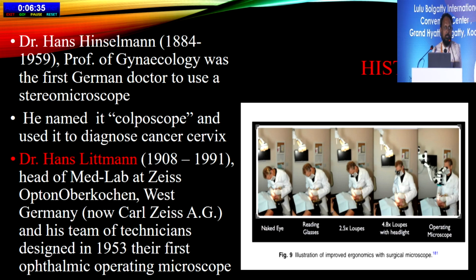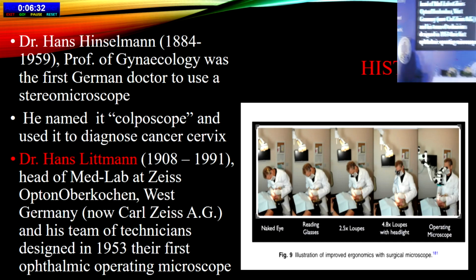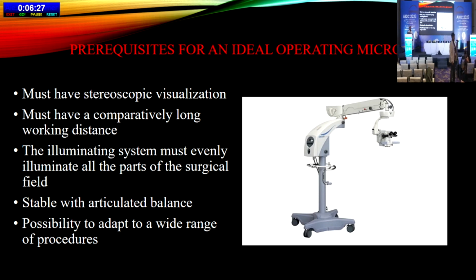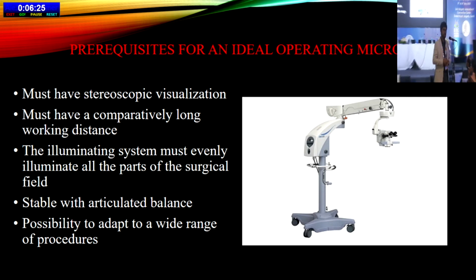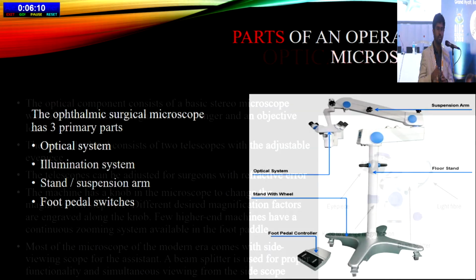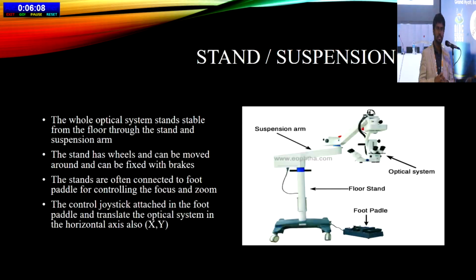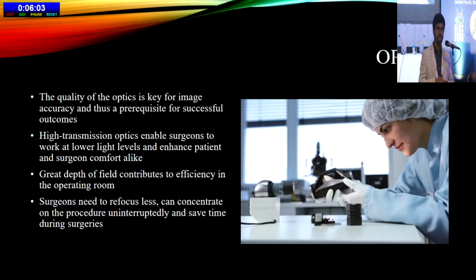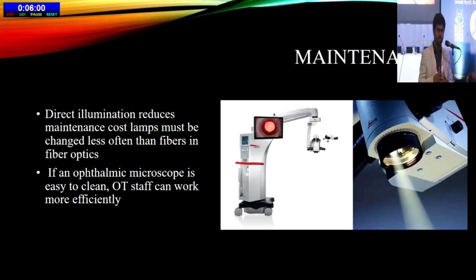Actually, I will say that there is not much loss of stereopsis, but the issue was I tried 2 equipments. With one brand, I had quite a lot of diplopia. I was not able to focus well. Mainly when we do the chopper, I was seeing 2. Then I called the company person and asked how this system works. Then I tried another demo with another company, and I was comfortable with it. There was not much diplopia. Loss of stereopsis, theoretically it is there, but when you operate, you're not seeing much, sir.